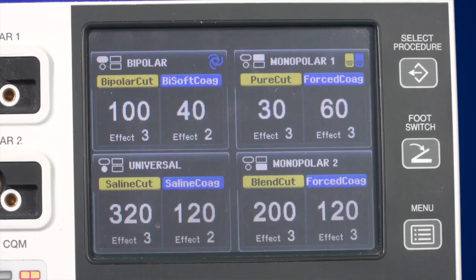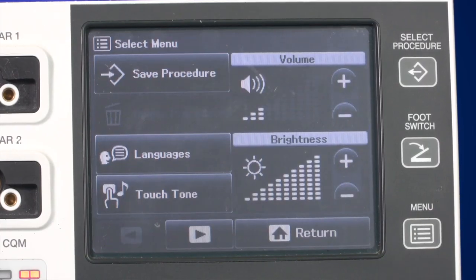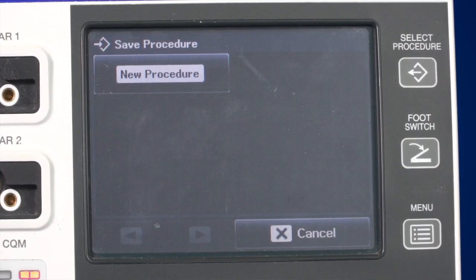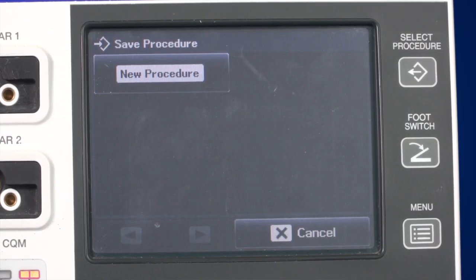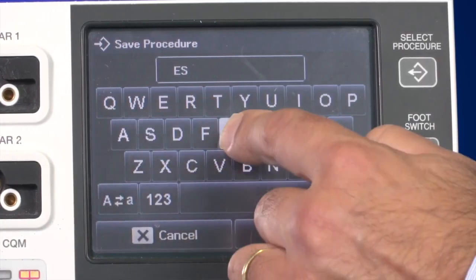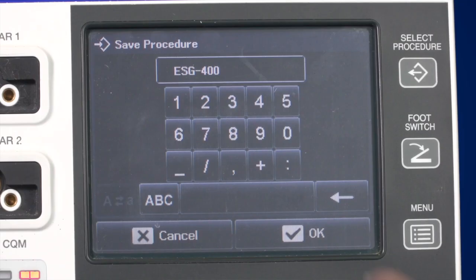When referencing the buttons on the right side of the ESG400, the upper button is the select procedure button, which allows you to select your personalised procedure settings. In order to save your procedure settings, press the lower menu button. After you have accessed the menu, select Save Procedure. Now you can either override a previously saved procedure or create a new procedure by adding a new name to the list. To complete the process, save the settings by pressing the OK button.